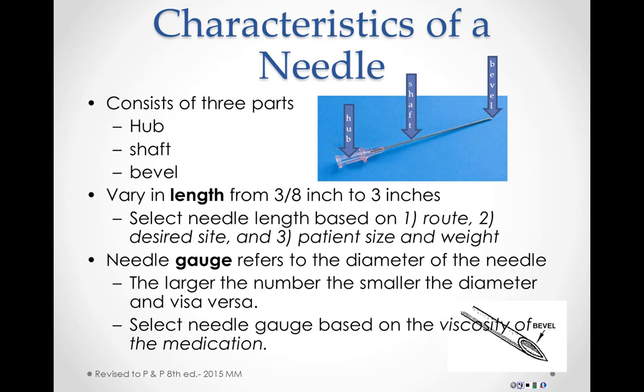The bevel creates a narrow slit in the tissue when injected that closes more quickly and neatly after the needle is removed. The nurse always positions the bevel up when giving an injection. If you're unsure which way is up, relate the bevel to a spoon. In the same way a spoon faces upward when in use, the bevel is up when the needle is injected into the tissues.